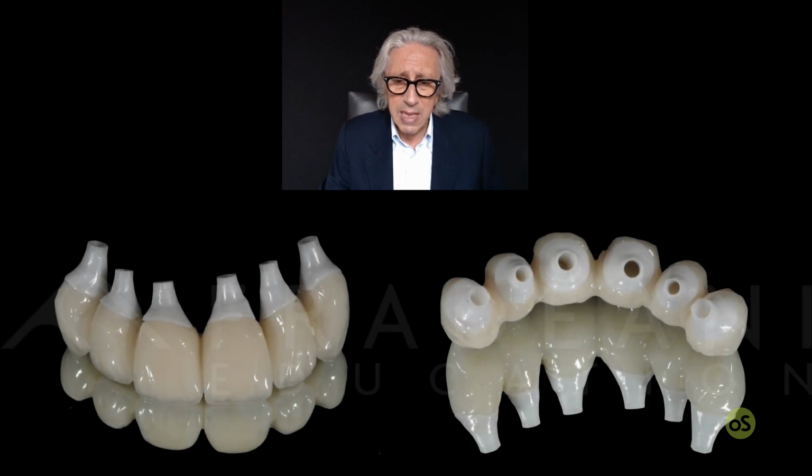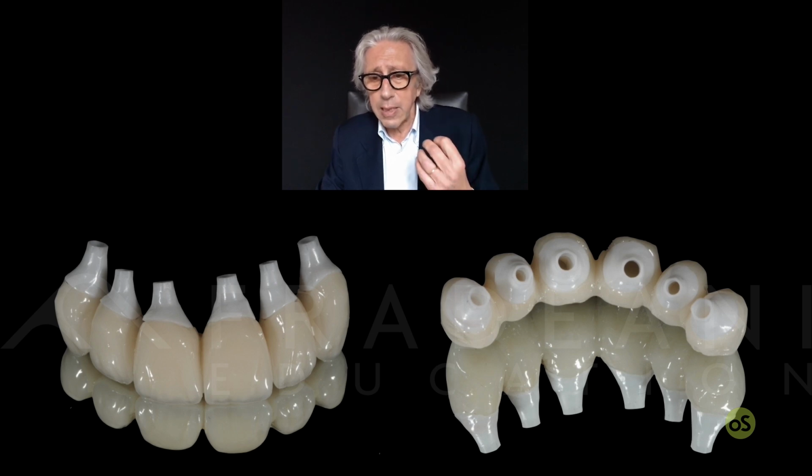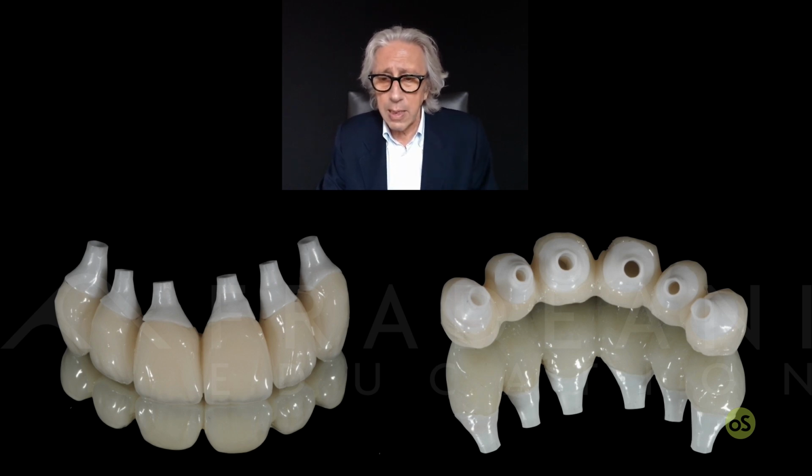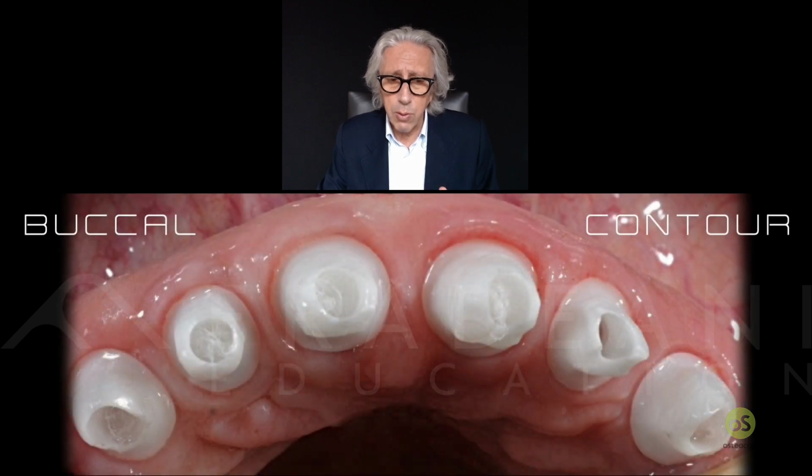because you have the chance in this case to have the ceramic abutment, which is something between the root and the abutment. So you have both in your hands. That never happens with the natural dentition. Natural dentition has the root inside. You cannot see it. You cannot manage the root. In this case, you can manage. You see the way we manage.